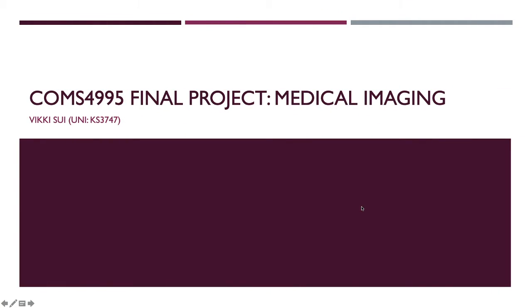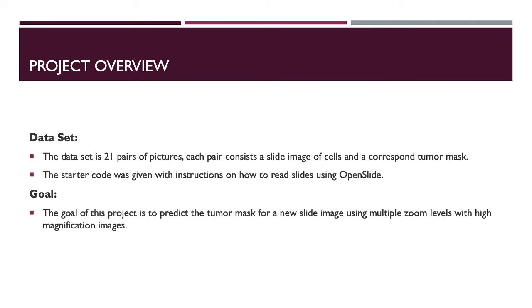Today, I will present my final project, which is on the topic of medical imaging. First is the project overview. The dataset we have is 21 pairs of pictures. Each pair consists of a slide image of cells and a corresponding tumor mask. The starter code was given with instructions on how to read slides using OpenSlide.